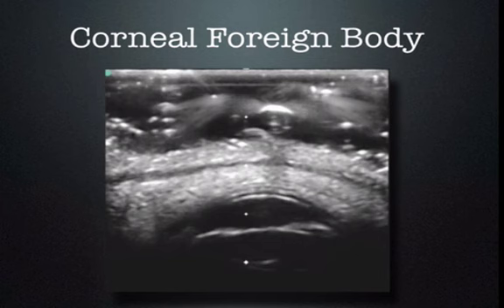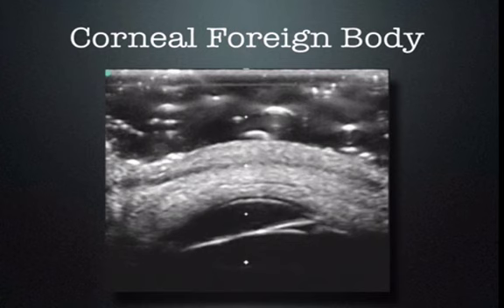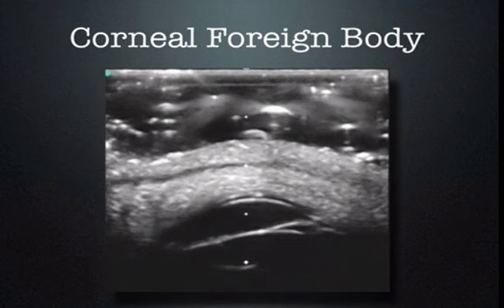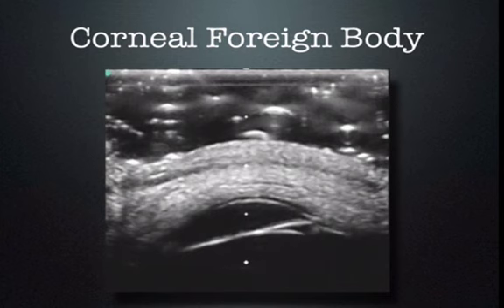Here we have a corneal foreign body. We can see the lid very well, the tarsal plate — the hypoechoic line going across the eyelid — the rest of the eyelid, and then the anterior chamber. When we look at the anterior chamber, we can see a hyperechoic structure moving back and forth. In this case, it is a metal foreign body in the cornea that did not penetrate the globe itself.